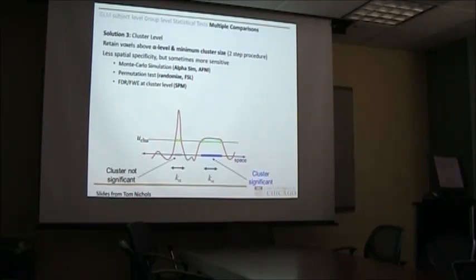And there are a bunch of different implementations of cluster level statistics. It's not really worth going into the details, but each package basically has their own way of implementing these things.